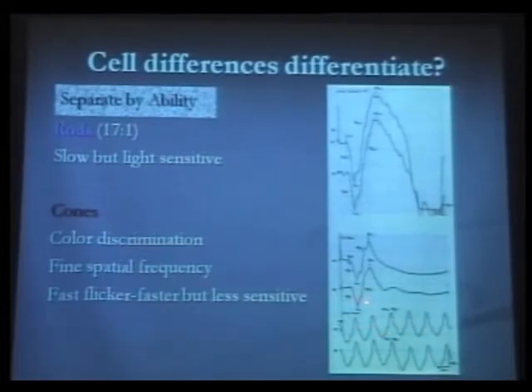You can do a single flash in a light adapted patient and look at your photoreceptor and your B wave response, and also look at cone function. What you'll notice is that this amplitude response is much less than the mass response you get by looking at all of the rods, which are outnumbering the cones 17-to-1.